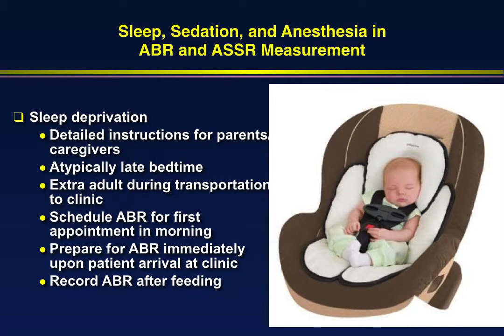Constantly stimulate the child. Don't let them fall asleep. As soon as the child starts to get drowsy, stimulate them with lights, with activity, with movement. Don't let them fall asleep.